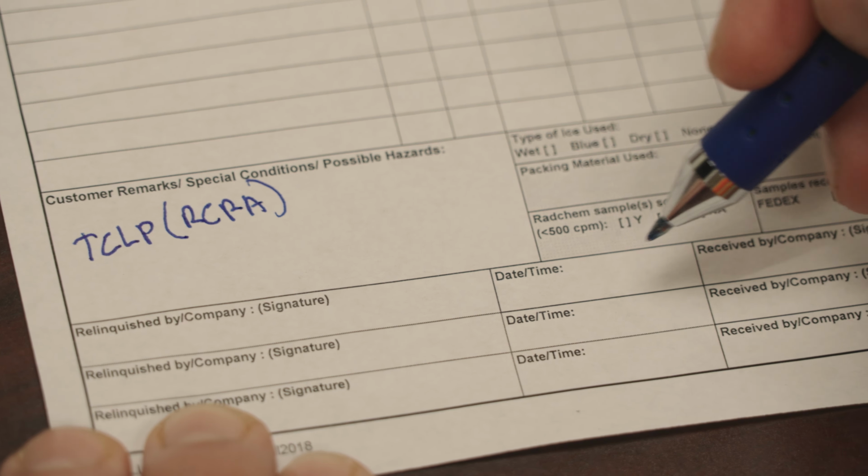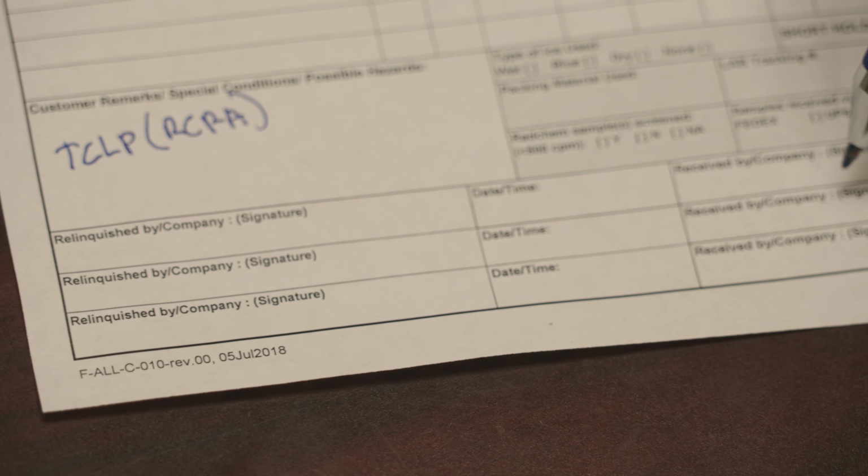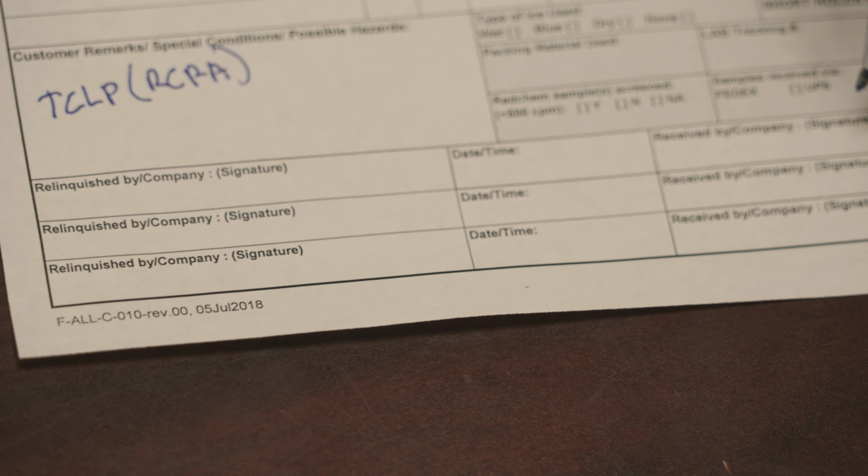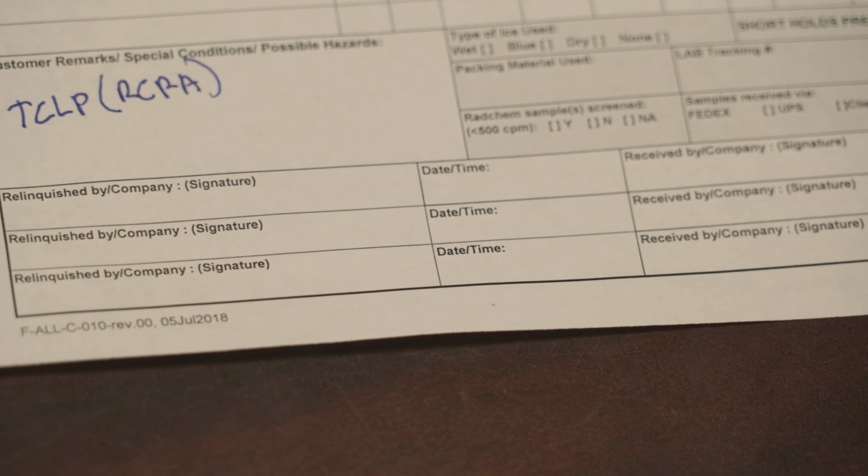This section down here is for when it actually ships out, so this is the important chain of custody information. So when I turn this sample over to someone else, or if someone else at our facility turns this over to the person who's transporting it to the laboratory, for example, that's where this line will get filled out. So we're going to leave that blank for the time being.